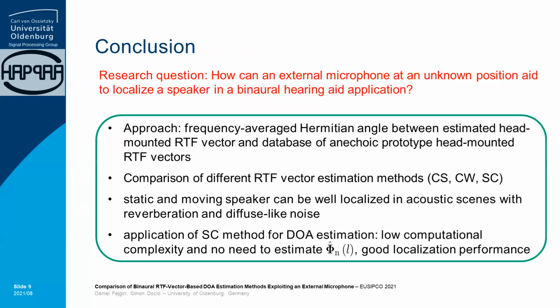And briefly as an outlook, in future work, we want to tackle not only the single source DOA estimation type, but also the multi-source DOA estimation task. We want to be able to track multiple sources in a room. And moreover, we also want to investigate how a target speaker can be jointly localized with a hearing aid user when the microphone array is not calibrated, so when there is no relative microphone information given a priori.